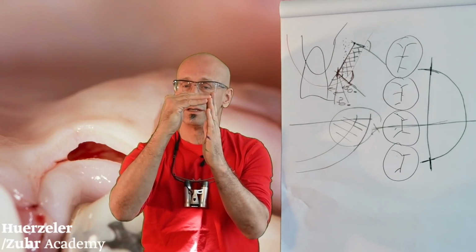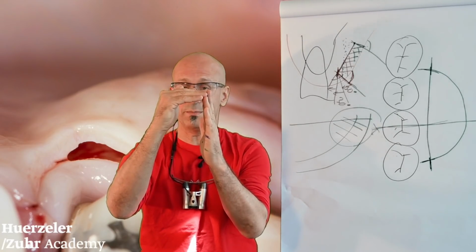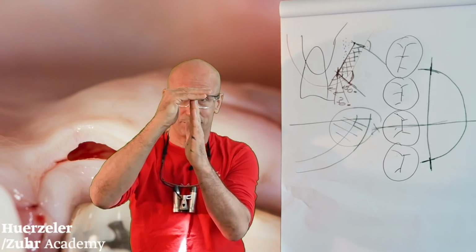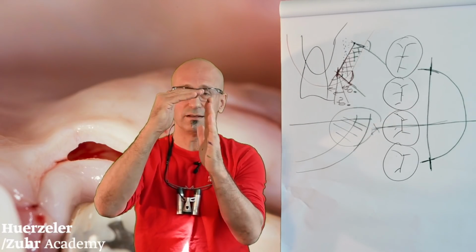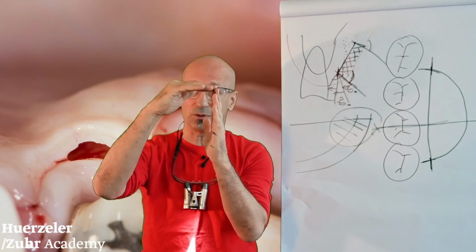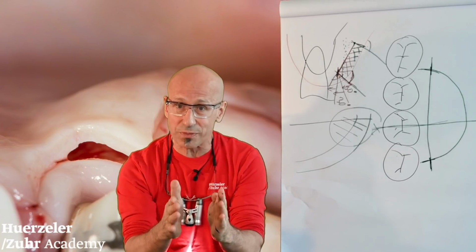You want this. You don't want it too thin. You want this thickness, 1.4 millimeter. So not too thin. Some people make the flap perfectly in the design, perpendicular, but too thin. That's what we don't want. Then, after that, if we have the right flap coronally, we want to prepare equal thickness to the base.